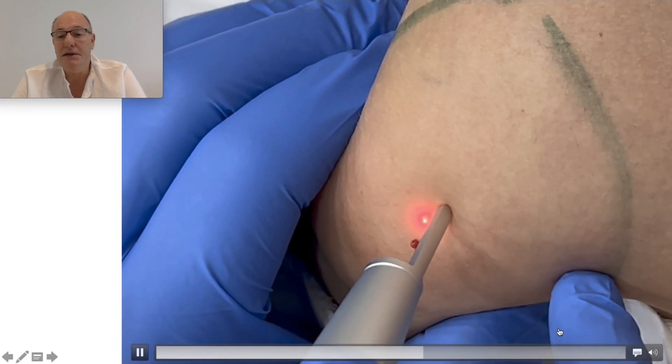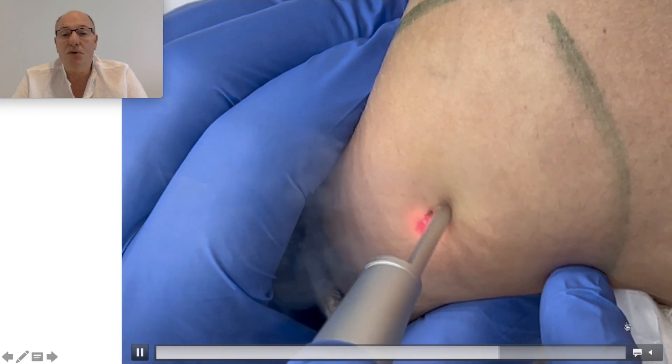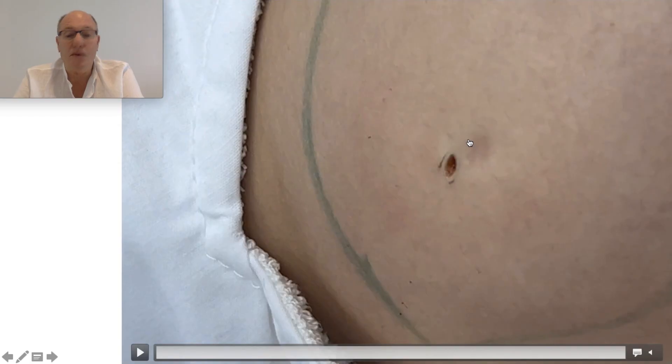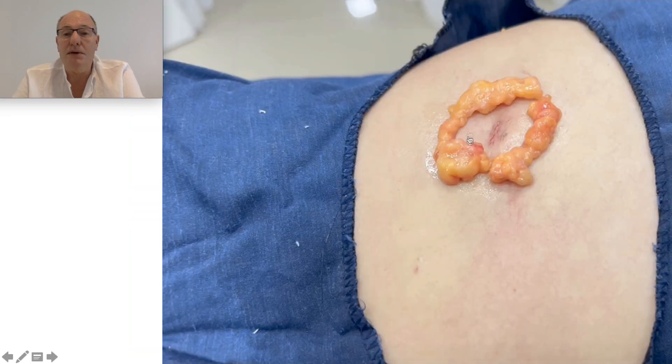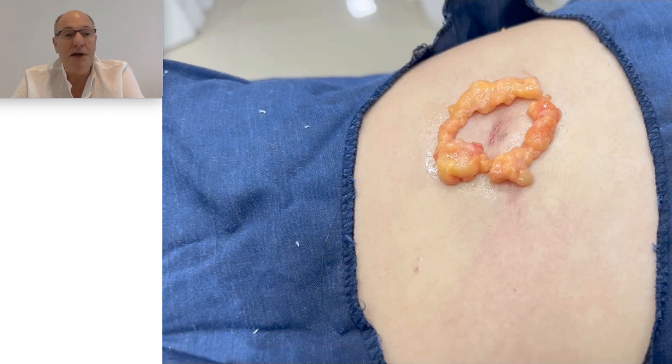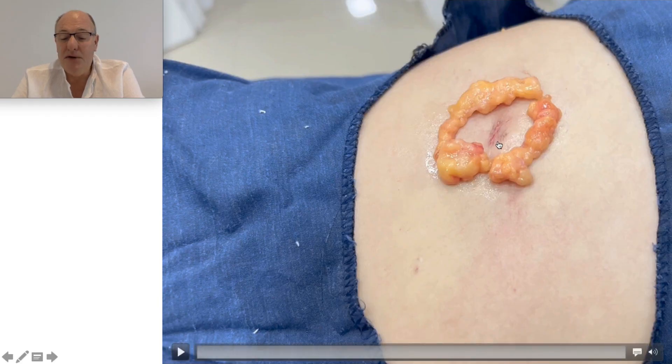I'm doing, in this case, a small incision like this with the lipoma, through which I'm looking to remove all the lesion. Here we can see all the tumor was removed. The difference with my technique is not only to perform a small incision with laser — and many of them do not need sutures — but I remove the full tumor with this technique.